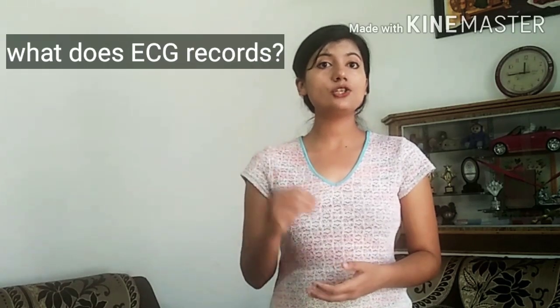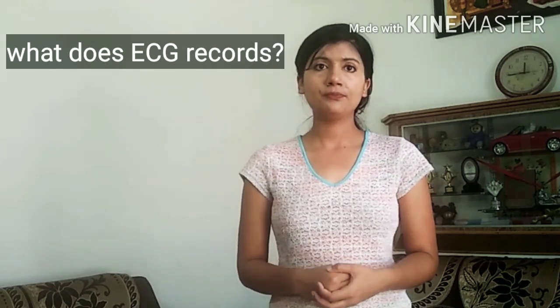Now the third question: what does the ECG record? The ECG records the electrical activity of the heart, but it doesn't tell us anything about the pumping ability of the heart. ECG can tell us about the structural abnormalities of the heart, like hypertrophy of the heart chambers, dilatation of the heart chambers, conduction system abnormalities in the heart, etc.